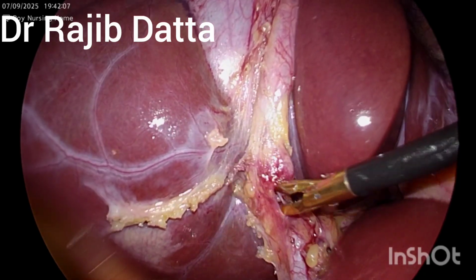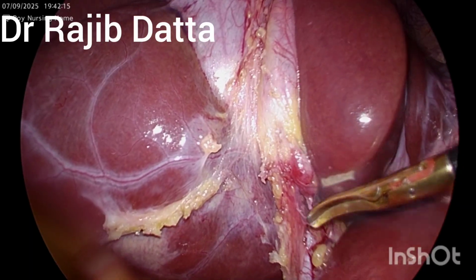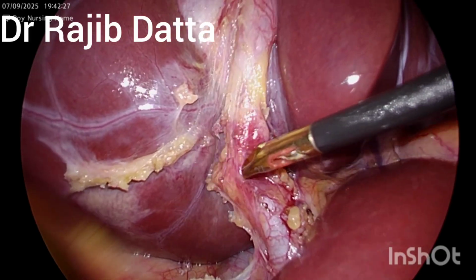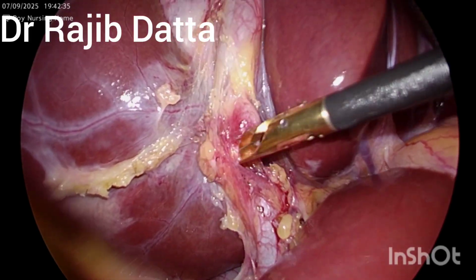So small pressure and small jaw opening is the main key here, and the fimbriae in between this opening will be cut with the help of the bipolar shearer.